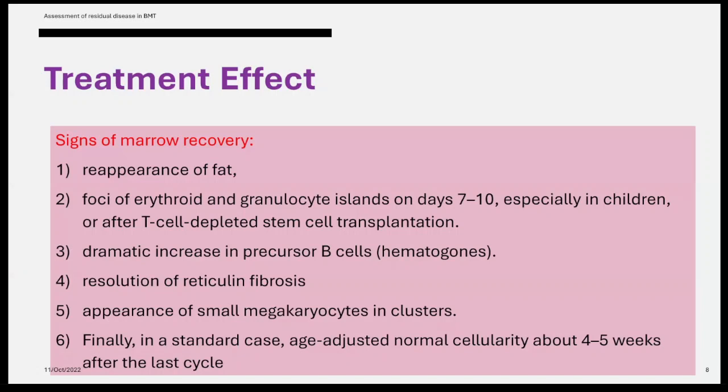However, the majority of these cells, maybe 90% of these cells, are dispersed individually without forming clusters. Only very occasional two cell clusters are noted. You can capitalize the words very occasional too, so that the clinician does not overlook the words, because we are telling them that this is hematogones.